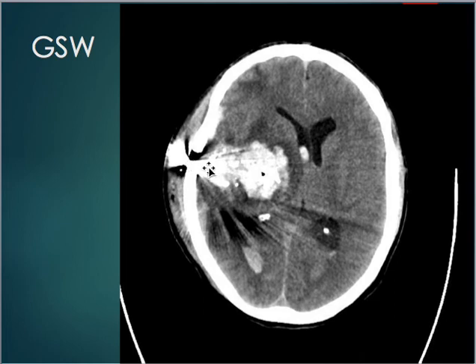What that also did is it caused that midline shift, pushed the ventricles way up and is kind of smushing them a little, and then that midline is moved over, right? It's not completely straight, dividing it into equal right and left halves.